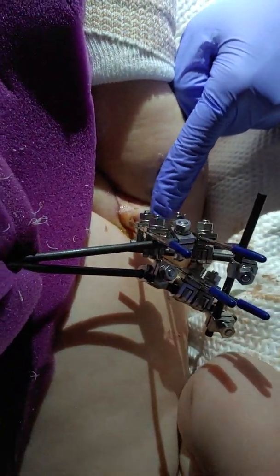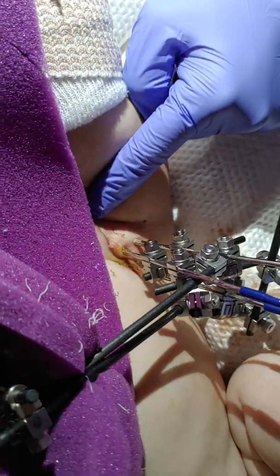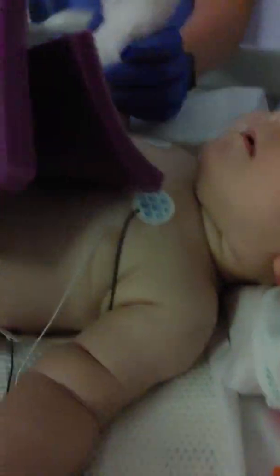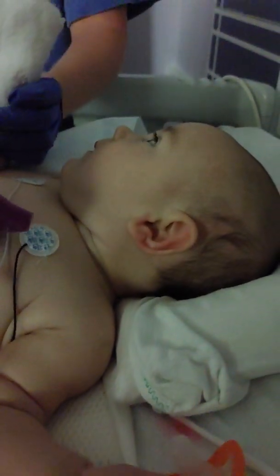Yeah, sure can. Just take Q-tips and like half hydrogen peroxide and just get all his gunk off. That looks good. His is all Dermabond over there, so you don't have to worry about getting that wet. That's fine. It's all sealed off on both sides. His Dermabond's intact on the other side. I was gonna redo his feet now, because he's kind of trying to wiggle out of that. Yeah. You're doing so good.